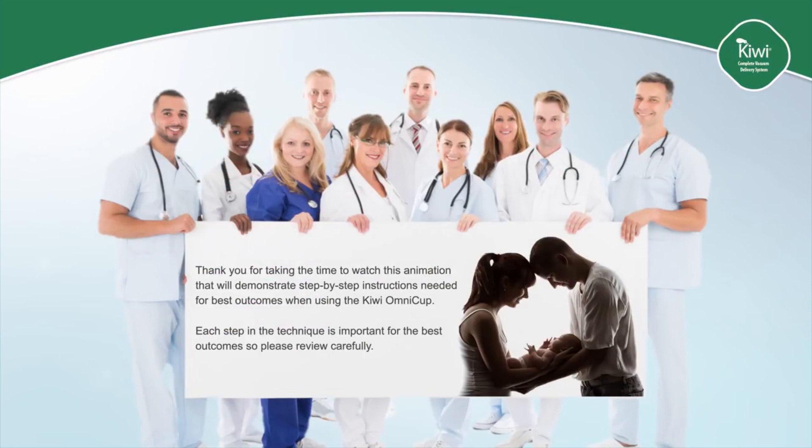Thank you for taking the time to watch this animation that will demonstrate step-by-step instructions needed for best outcomes when using the Kiwi Omnicup. Each step in the technique is important for the best outcomes, so please review carefully.